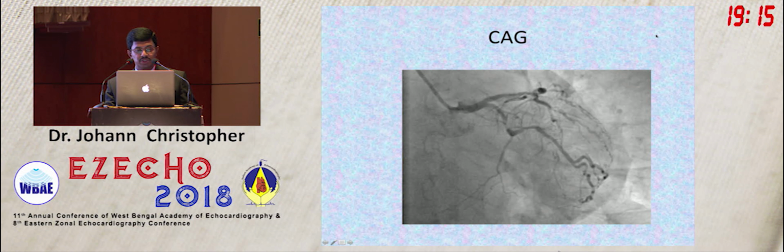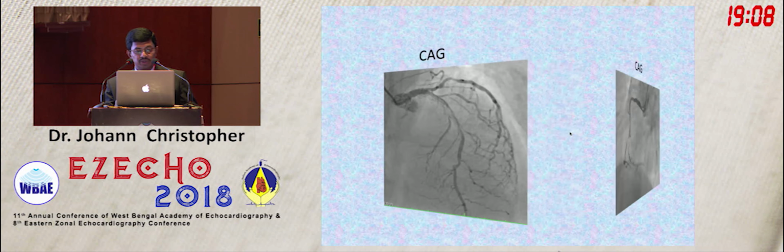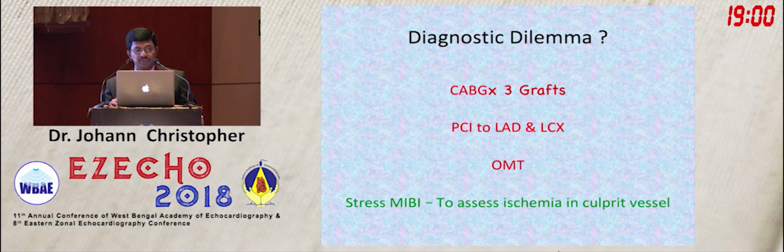These are still images. You can see the circ lesion here and a long segment LAD lesion. And you can see that the right has a total occlusion with retrograde flow from the left. So a triple vessel disease. So what would you like to do in this lady? And I just gave you a little snapshot of the fact that she is elderly. She's not wanting any intervention. So how do we go from there?